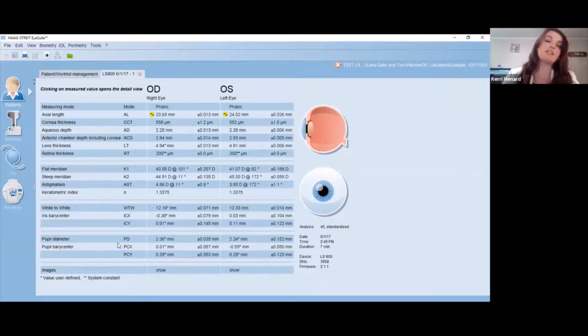Similarly in ophthalmology, pupillometry is used for your physicians to quantify or qualify your patient for a multifocal lens. But if your physicians are not interested in reviewing these numbers, then you do not have to take the extra time to adjust these gates or review if you do not have pupillometry measurements.